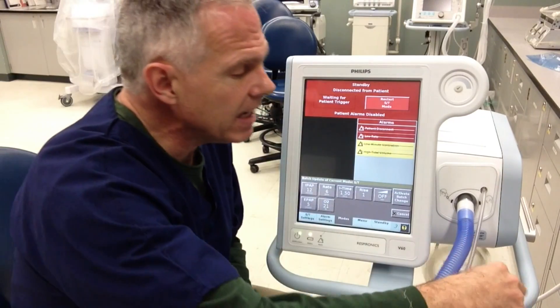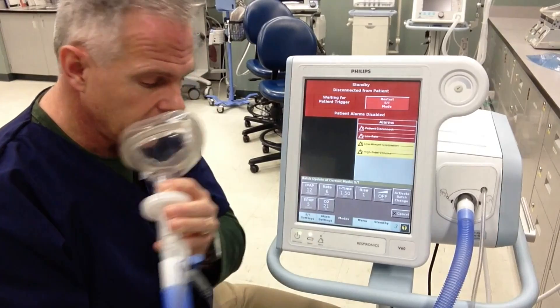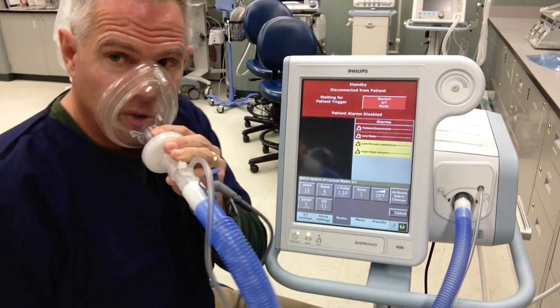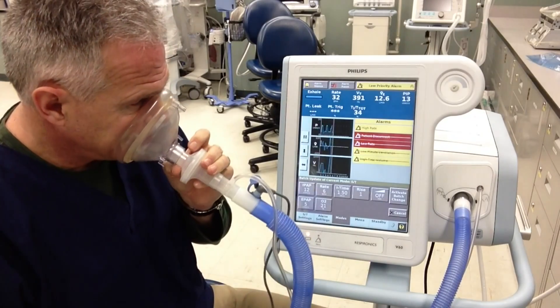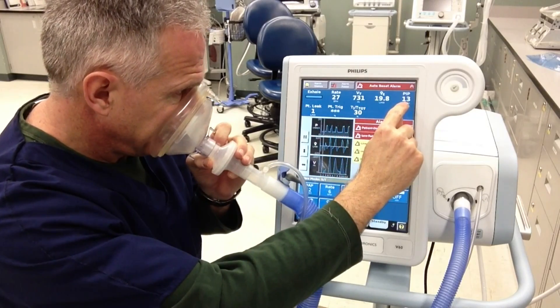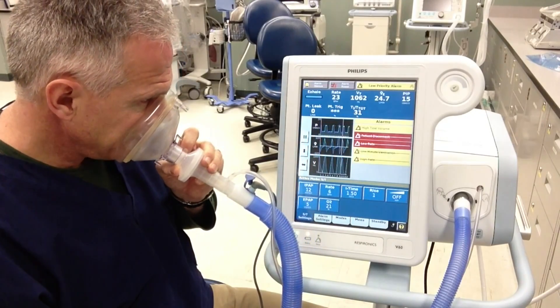I'm going to breathe on here again so you can see the tidal volume, respiratory rate, and other parameters. It automatically will trigger on as soon as I start breathing through the circuit here.